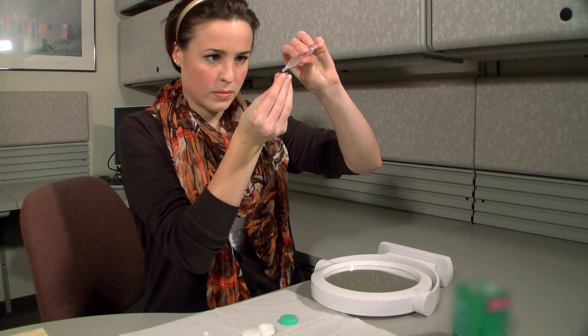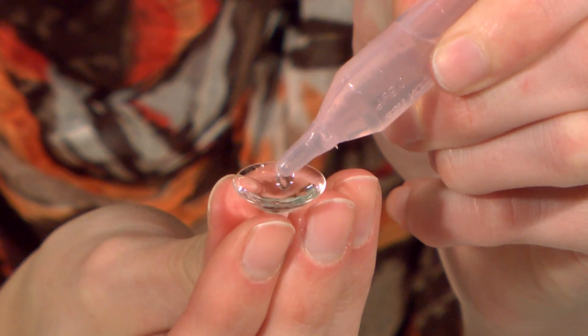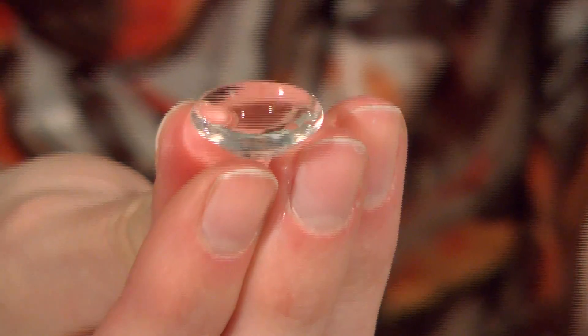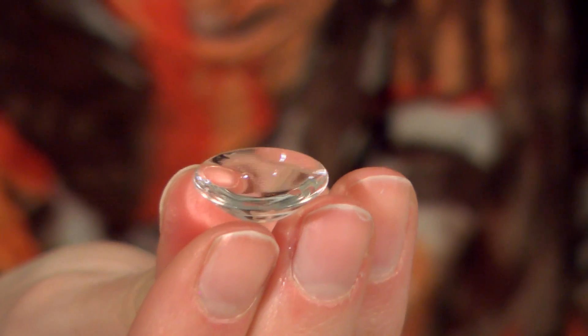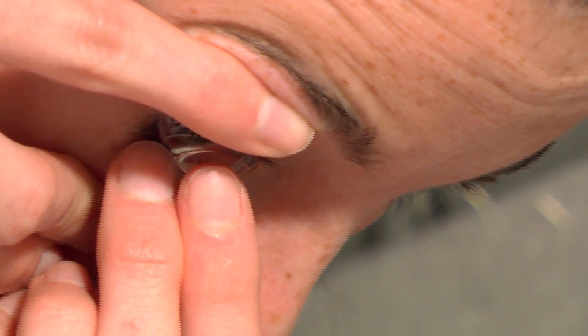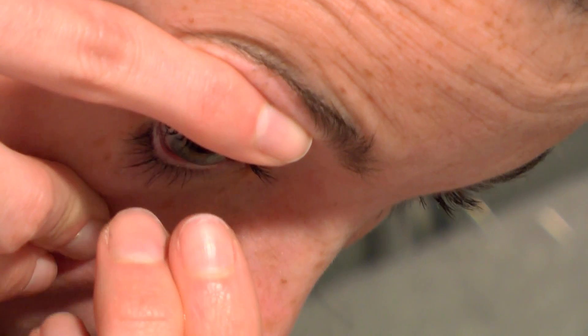Depending on the size of your scleral lens, your eye care provider may have advised you to fill the bowl of the lens with preservative-free, buffer-free saline. Filling the bowl completely is necessary to prevent air bubbles from being caught between the lens and the cornea. Chemical-free saline is necessary to keep the cornea healthy and comfortable since there's minimal fluid exchange under the lens after insertion.